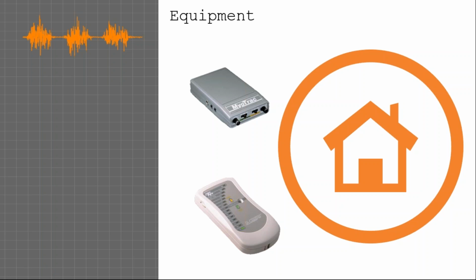So we're not going to be able to get the objective data that we would see in Biograph, but it's enough for the home user to use, saying, I'm trying to get to this level, I'm getting to this level, and I'm getting some sort of feedback. Both have multiple feedback mechanisms, and our U-Control unit is going to also have some work-rest protocols as part of it. So again, home trainers, simple tools.